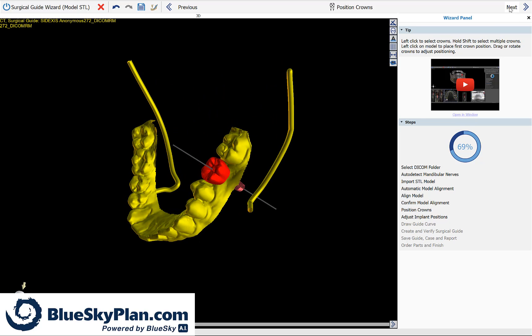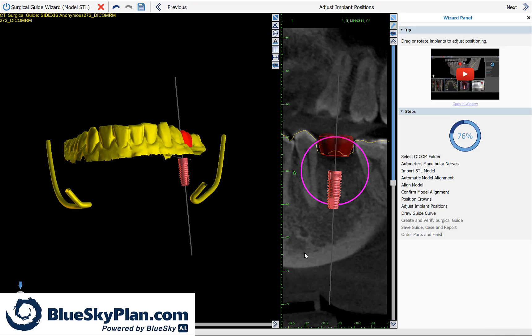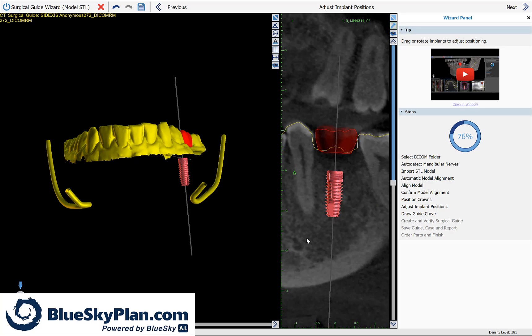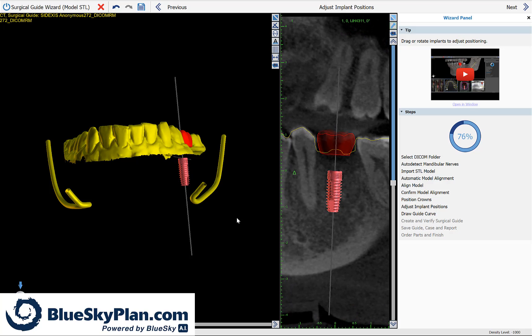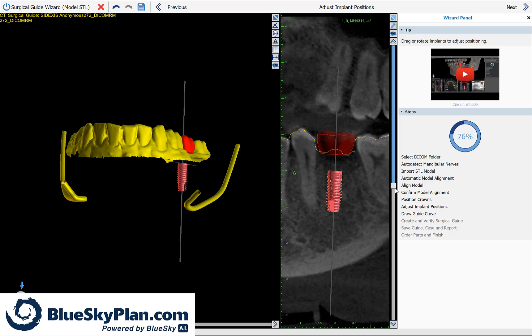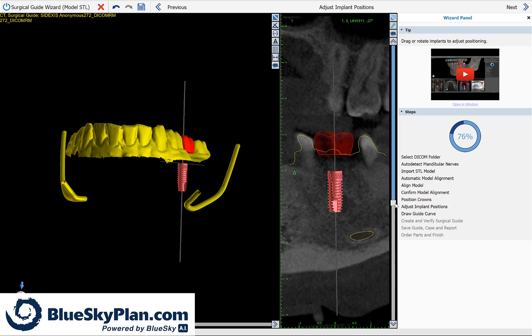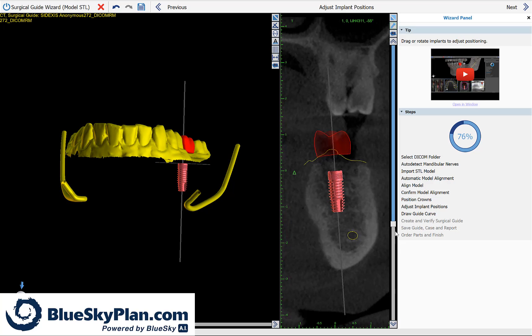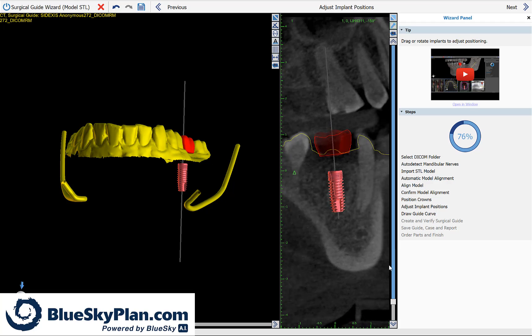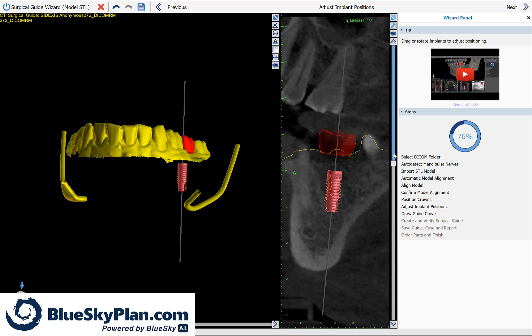And we can see that the tooth together with the implant has now been placed. If we go ahead and click on Next, we can confirm the alignment of the tooth with the implant in the 2D view as well. If we use the slider, we can rotate around the implant in 360 degrees.